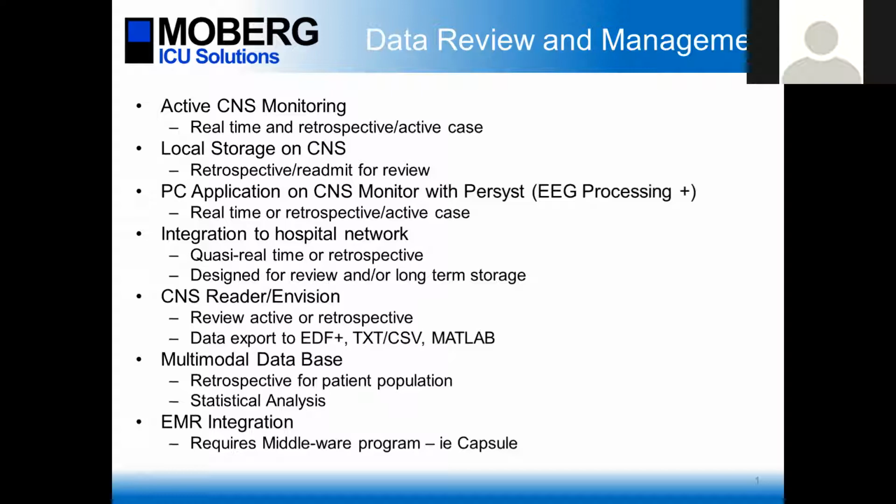Okay, great. So let's talk about something briefly called the CNS Reader. It's actually being rebranded as CNS Envision. So you may hear it referred to as the Reader, you may hear it referred to as Envision, and the name is actually being changed because it's so much more than just a reading tool. It was initially put out there as something that is used to read EEG, but it does a ton more than that. This is an additional product.